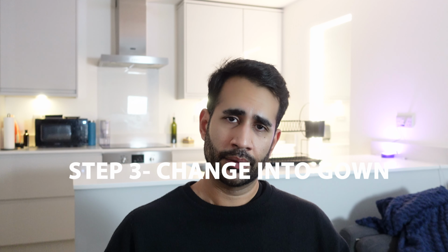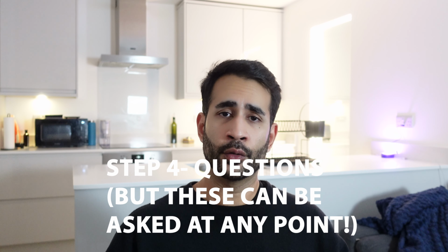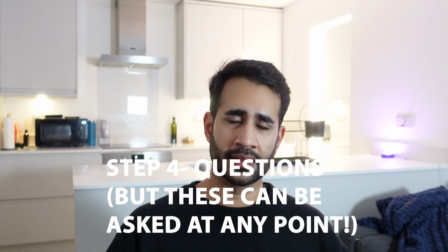Now then, you'll get changed into a gown for the procedure. Like I said, the doctor would have come and spoken to you as well, to go through consent and all that kind of thing. Just make sure you have a good understanding of the procedure, and then they'll also ask you whether or not you have any questions. And this could be a good time to ask any questions or any hesitations that you might have. But obviously, at any point during the entire procedure, people will be talking you through everything, and you can very much ask any question you want whenever something comes to your mind.